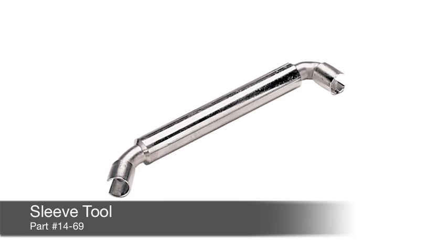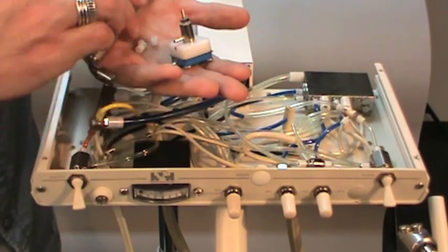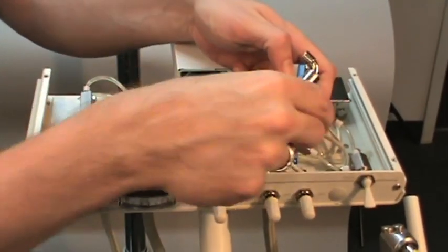Using our trusty sleeve tool, we are ready to install the new valve. Installation is as simple as reattaching the tubing, and it's easily completed by any staff member. No need calling a tech in for this job.